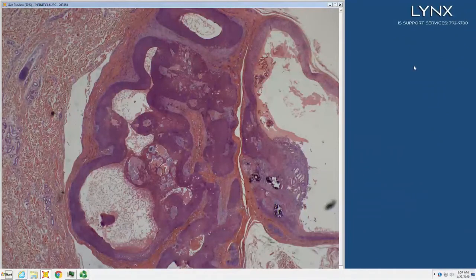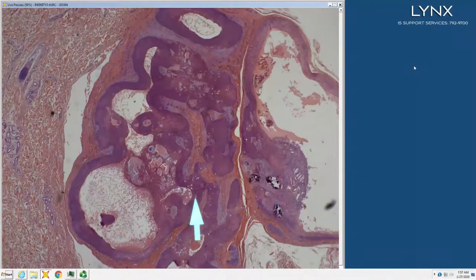It's large. It has cystic degeneration. Is there visible cytoplasm or no cytoplasm? Is there pink? There's pink, right? So there's cytoplasm. And what are all the little round white things? Duct. And there's no palisading. We may be at a little scanning power for that, but take my word for it. There's no palisading, there's cystic degeneration, there's duct, there's visible cytoplasm.